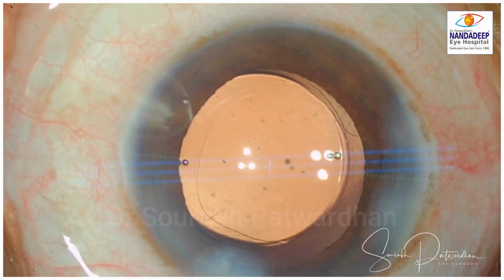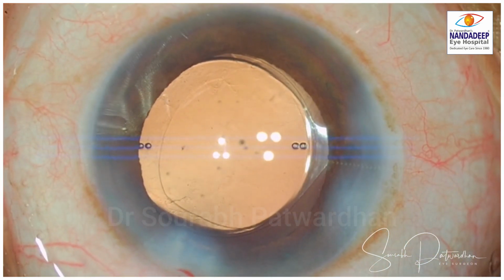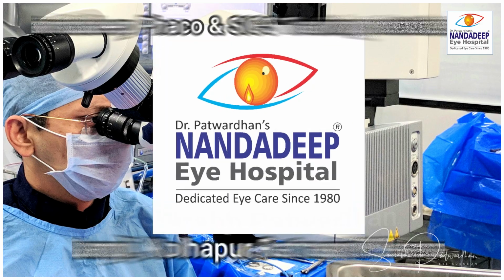So in this video you have seen the difference between peripheral rent and dialysis, and also how to notice the posterior zonular dialysis and how to tackle it. I hope this video was useful.